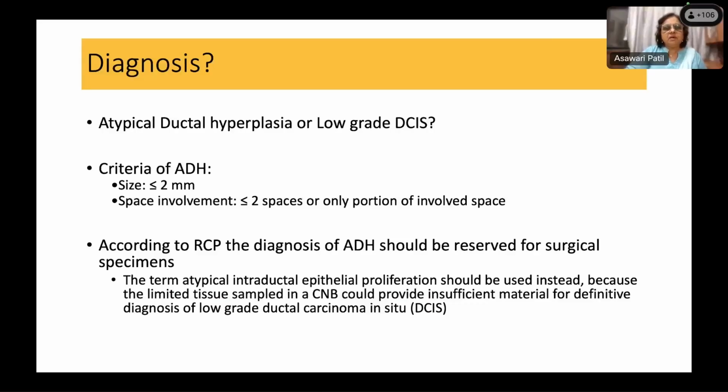There were a few comments about encapsulated papillary carcinoma, but I think you have also covered when to call it that and what the limitations are in a core needle biopsy for calling it encapsulated papillary carcinoma. So if it's covered, we can go ahead with the next case. But before that, let me ask the moderators if a question is there.